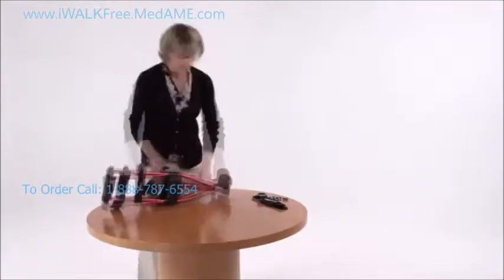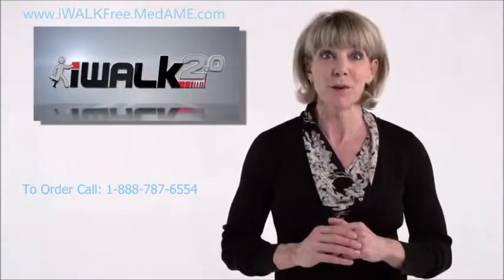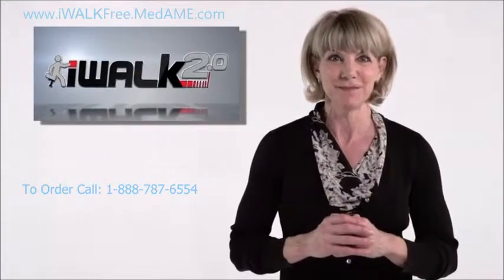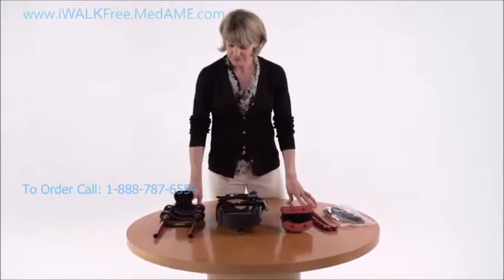I'm going to show you how fast and easy it is to assemble and fit your iWalk. There are no tools required and it only takes a couple of minutes, so follow along and I promise to have you iWalking in no time. First, let's separate and identify the parts of your iWalk.